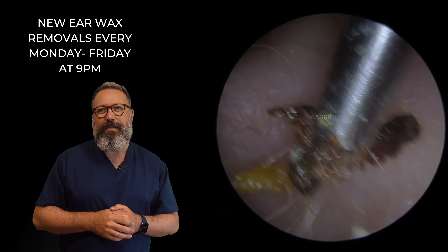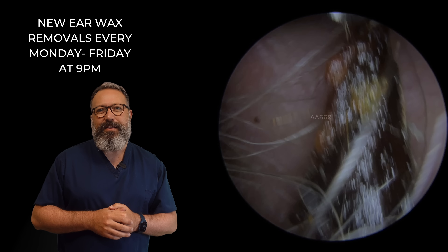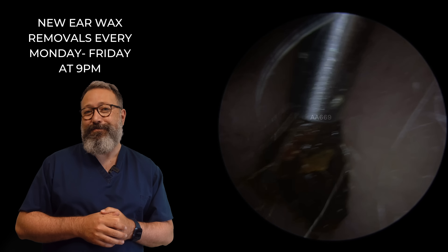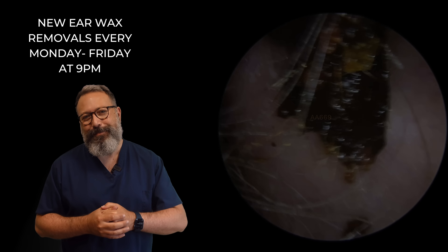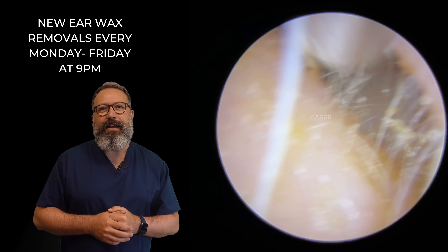There you go. Let's lift that up. And we've got another little piece just below it. There we go — that's the other part. This doesn't want to be picked up with suction, guys. This doesn't want to come out today. It's a bit camera shy, bless it. So you can see it's out — it's come. Let's take a look behind that now.